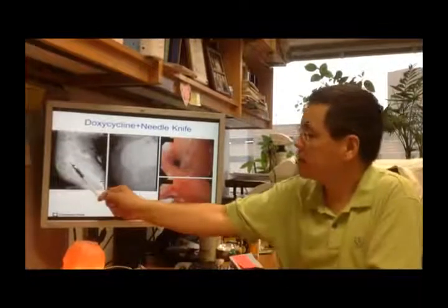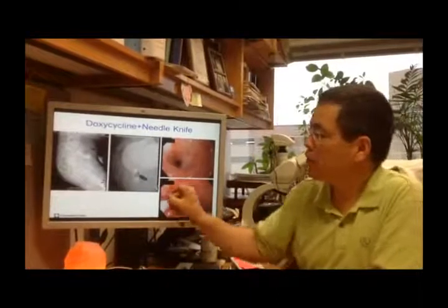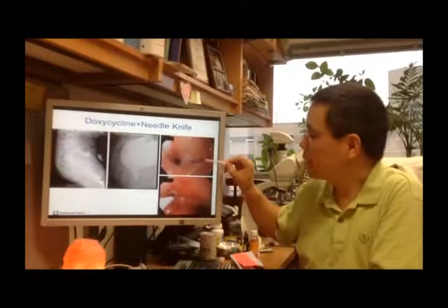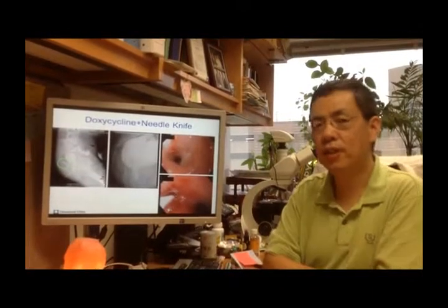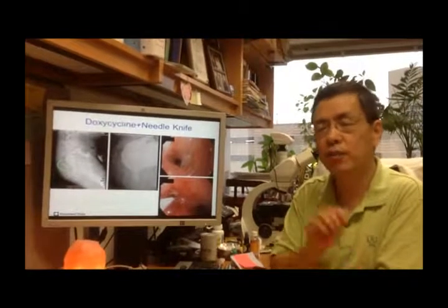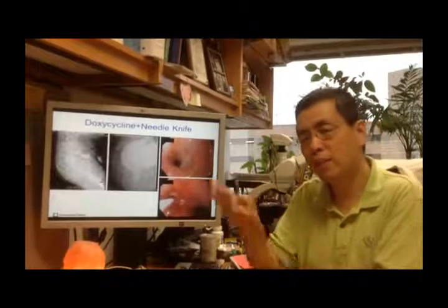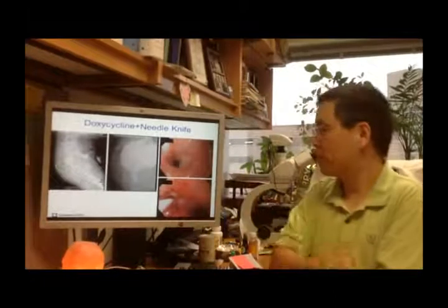Here is another sinus. Sometimes during sinus therapy, we cut the septum and simultaneously inject doxycycline, or sometimes inject D50 (50% glucose). The purpose of the injection is to promote fibrosis at the base of the sinus cavity, to fill the sinus and promote fibrosis there.